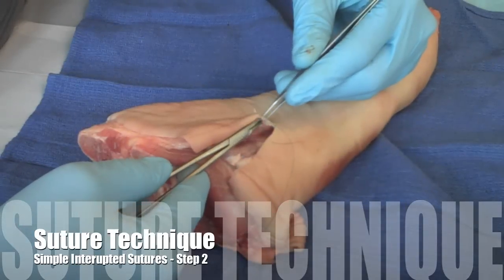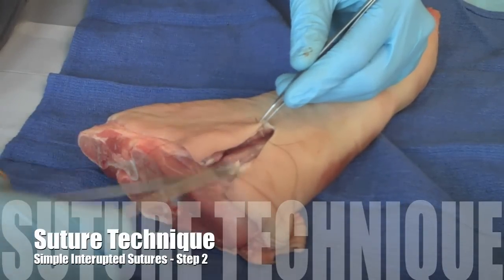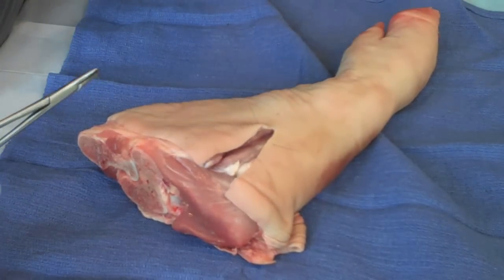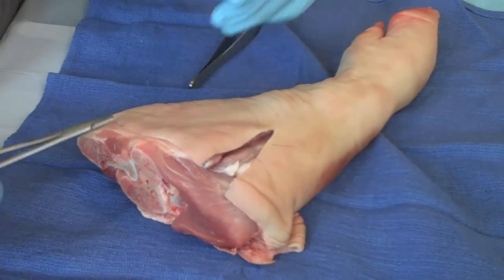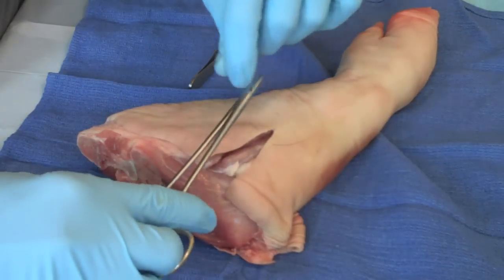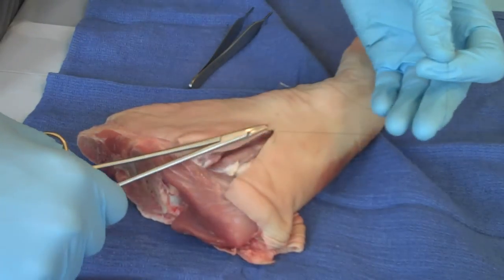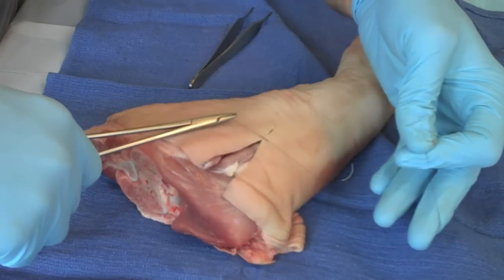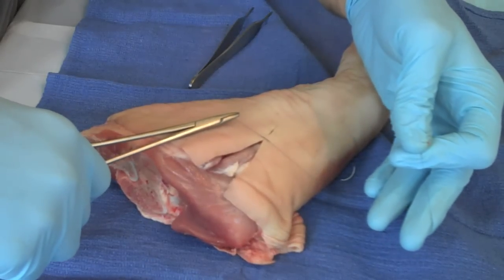A well-sutured wound will have wound edges that join appropriately and don't curve downward. There are several techniques you can use for that, but one of the things to keep in mind is just don't pull too tightly on the suturing — pull it across nicely and see how they join. That appears to join quite well.